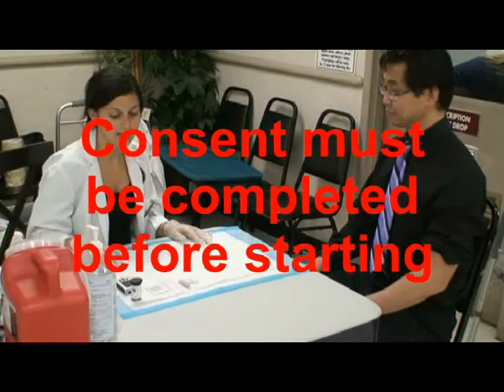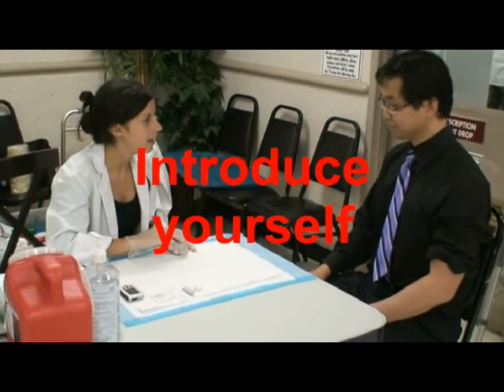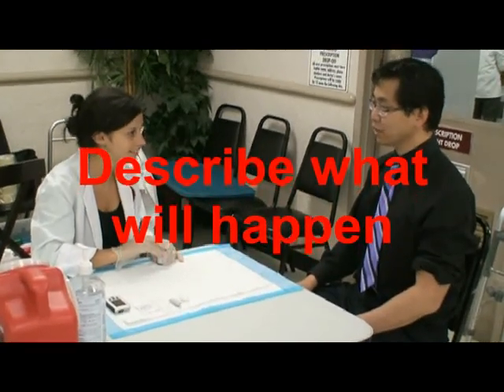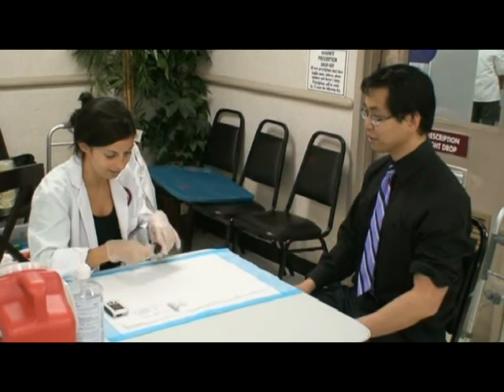Hi Jimmy, I'm Julia. I'm a student pharmacist here at Ohio State. I'm going to be taking your blood sugar and then your blood pressure and then getting your BMI. Okay. Are you ready to get started? Let's go. Okay.